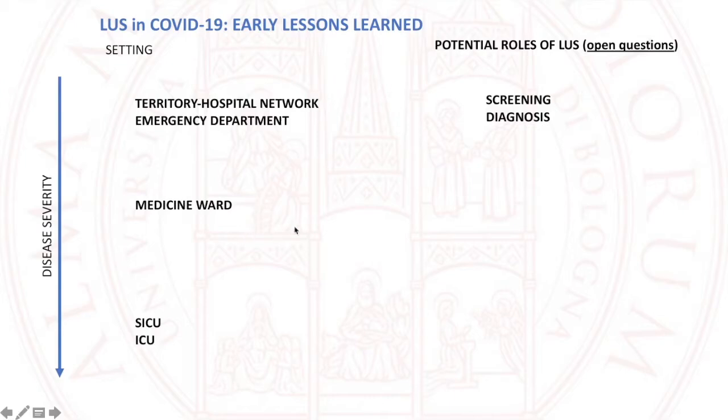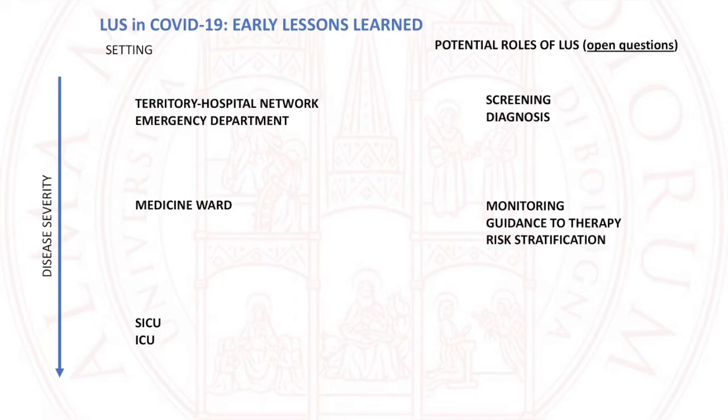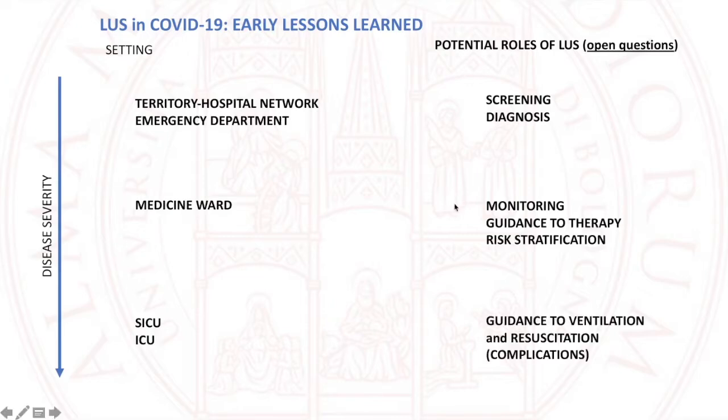Whereas in the medicine ward, where quite often the diagnosis is already made, we use it to monitor, to guide therapy, and to stratify the risk of patients, which means telling apart which are becoming worse and which are becoming better. In the ICU, ultrasound can be used to guide ventilation and resuscitation or to diagnose complications.